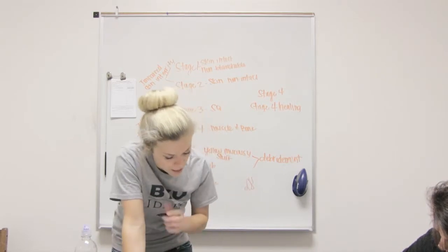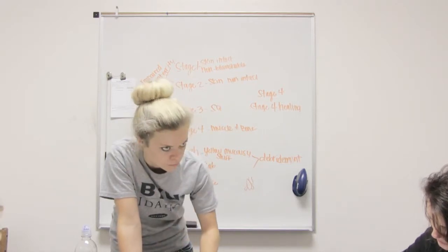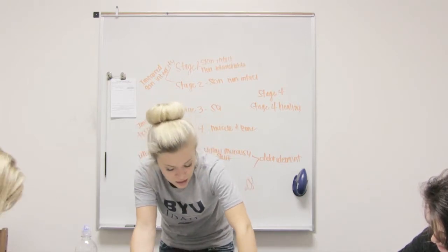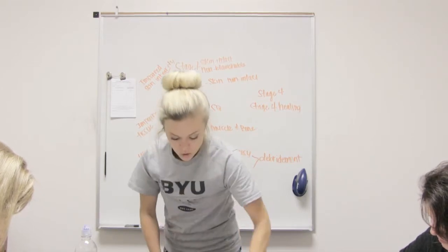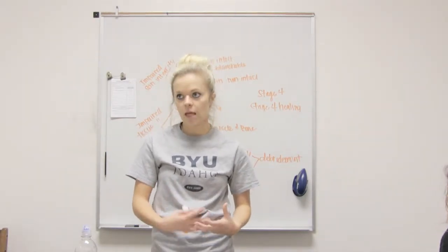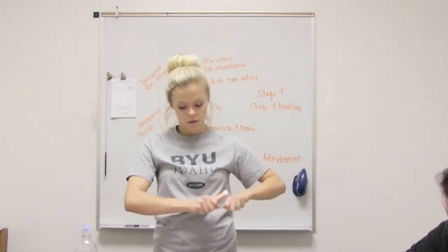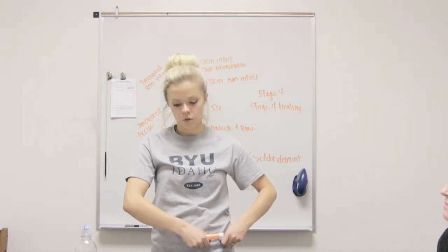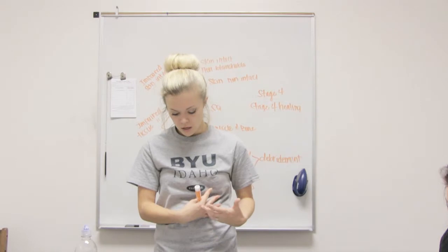Just so you guys are aware of that kind, just in case, but I really don't remember them going too specific into it, so go with what Sister Ward teaches you. The main idea is that we dress to protect the patient from seeing the wound. How would I change a dressing so that the patient doesn't have to see it? When you take the old one off and put a new one on, you'll want to peel it away, with the bottom towards the patient, and then stick the new one on so that they don't have to see their wound. That's how they taught us to do it.